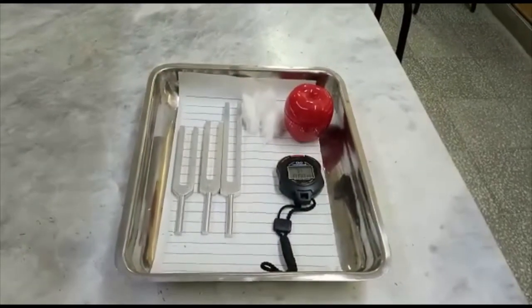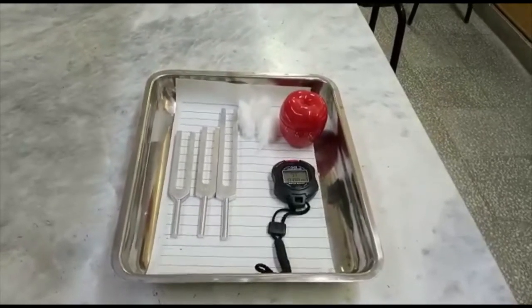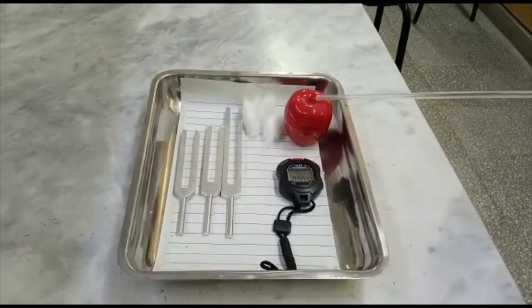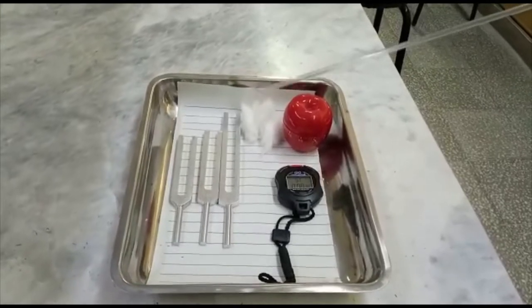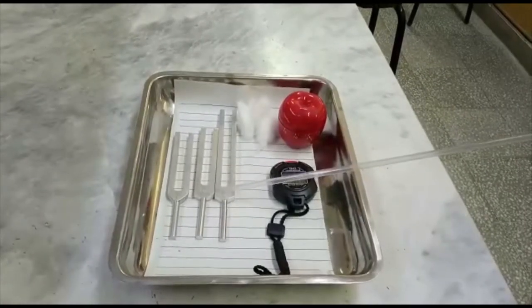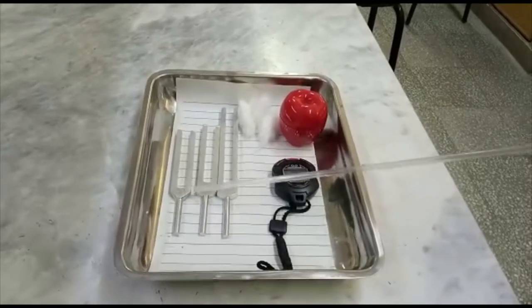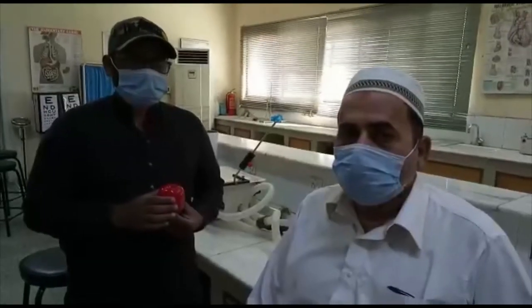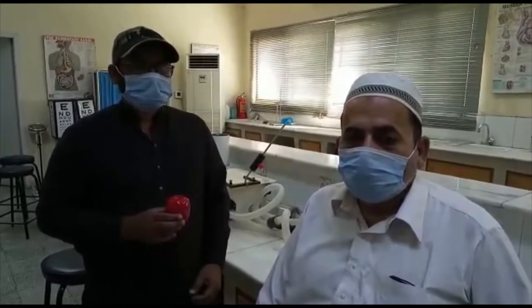Now we will look at the apparatus used in these tests. We will require this watch, which makes a ticking sound. These are the ear plugs, used to plug the ear. This is a stopwatch. And these are the tuning forks — you can see that their size differs and the frequency is written on top of each tuning fork.